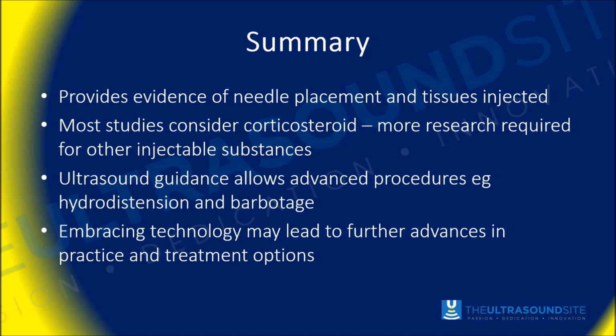So while we're training up our workforce to perform these, we may be developing other practices, other treatment techniques again, and we will have a workforce that is ready, willing, and able to carry out these treatments as and when they're being developed. So it's important to embrace technology for the future development, potentially for injection procedures, and we know that lots of minor surgical procedures are also now being carried out under ultrasound. So we don't want to lose this technical skill, as it were.